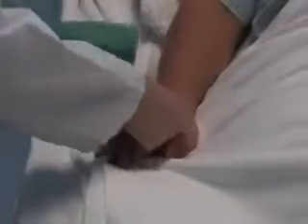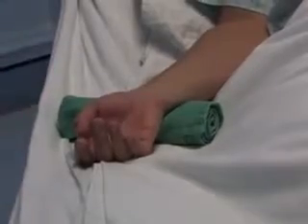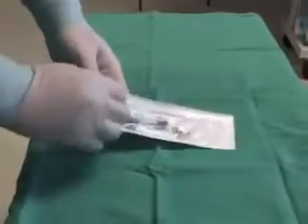Extend the patient's wrist and place a rolled towel under it to maintain it in an extended position. Once the patient's wrist is positioned, put on a non-sterile gown and non-sterile gloves. Open the arterial blood gas kit and identify all the components so they are ready for use.